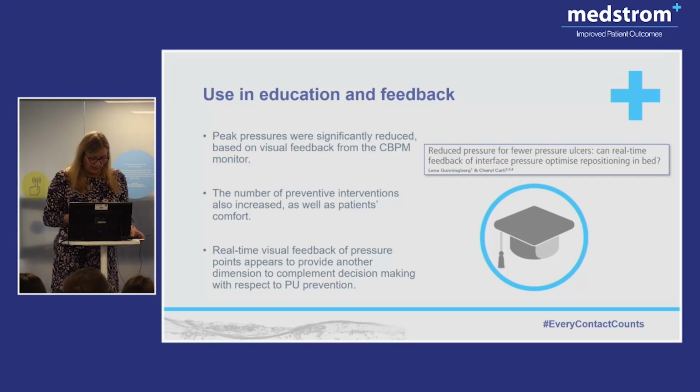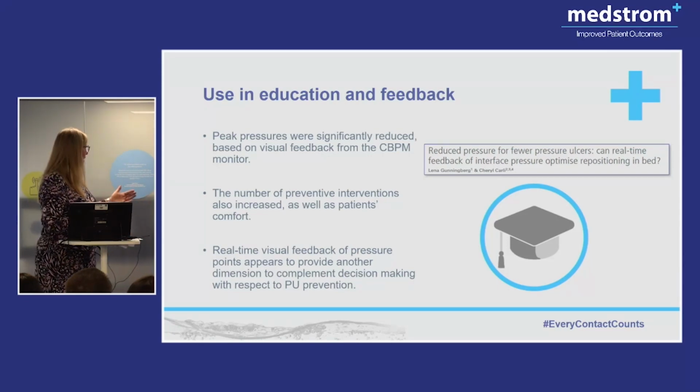They've also been used a lot in education and feedback. So again, if you go to the literature, you'll find several studies, most of them done in Scandinavia, looking at use in education and feedback for staff and for patients. You can see this particular study from Gunnenberg and Carley showed that when they used them in their training sessions, they got reduced pressure for pressure ulcers, reduced peak pressures, and the number of preventative interventions was increased.